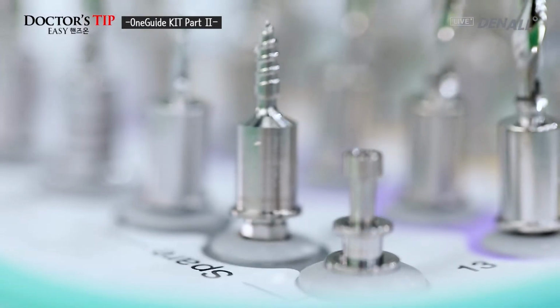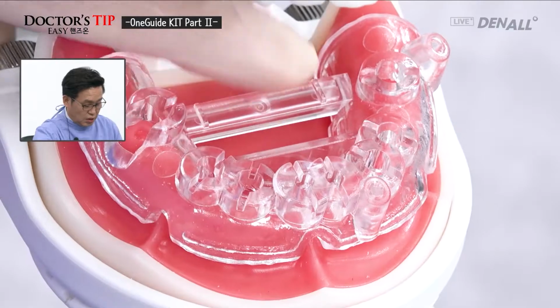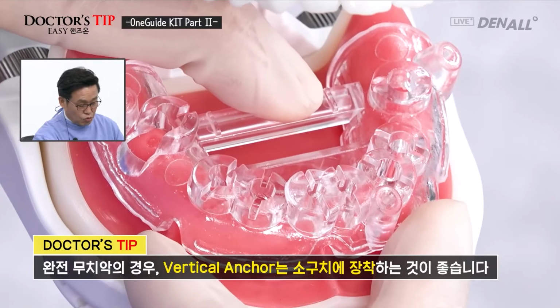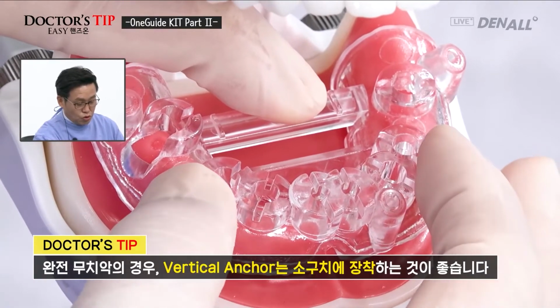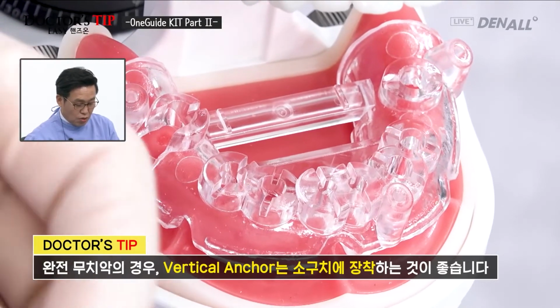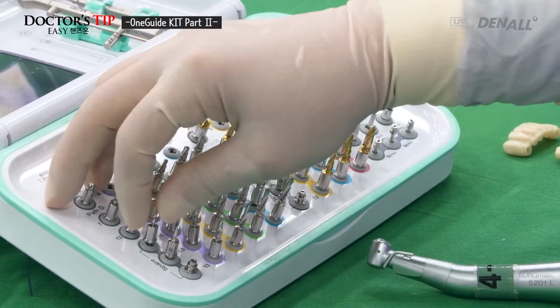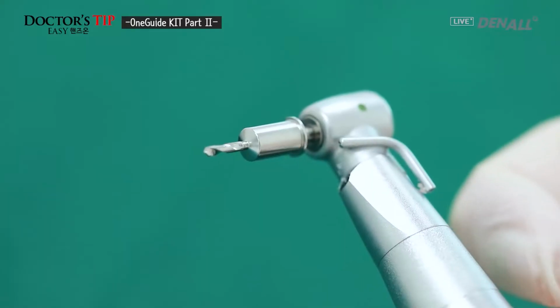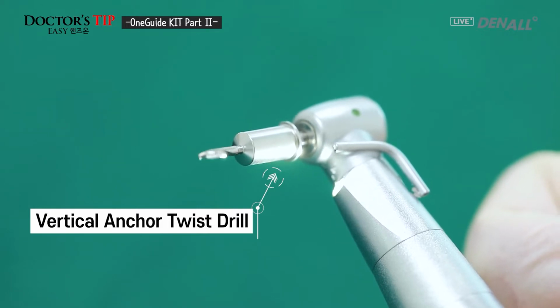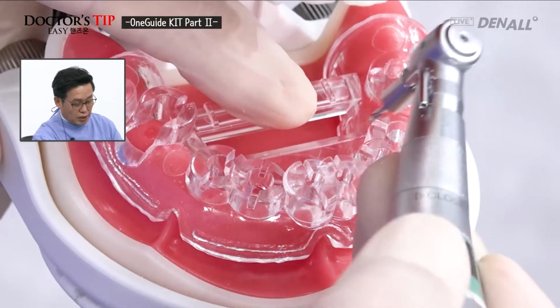As mentioned earlier, vertical anchor is going to be first used. Vertical anchor, in the case of fully edentulous case, the best area is the premolar region, so drilling is done in number 4, and vertical anchor, I'm going to use a screw here. Drilling is done. This is a fully edentulous case.